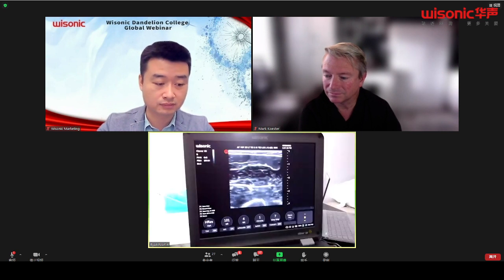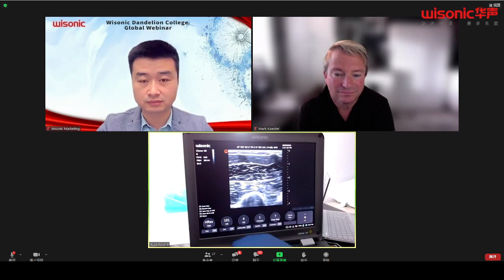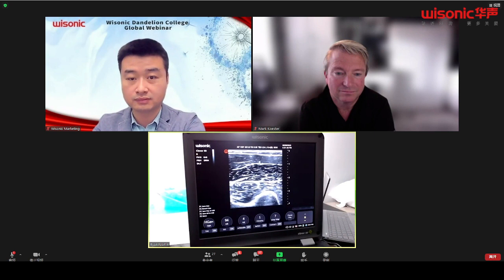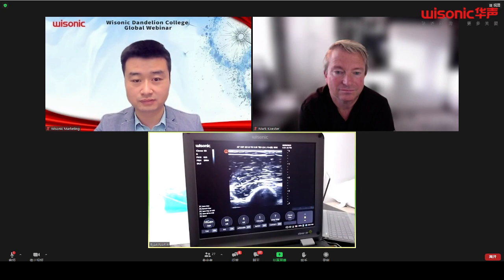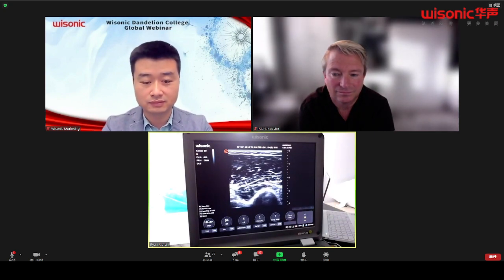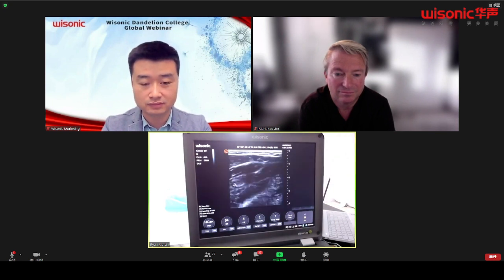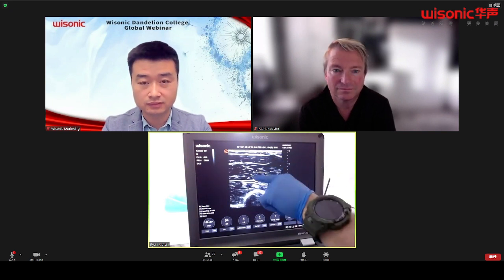All right, so everybody can see this. Hopefully it's not too bright. Let me turn some stuff down here and see if we can get it to. There, I'm liking that a little better. Hopefully everybody's seeing that clearly. I know these cameras on these computers aren't always the greatest, but what we see here is that distal biceps here. And so let me see if y'all can see what I'm seeing here. All right. So up into here, we have that distal bicep and the brachialis down here.